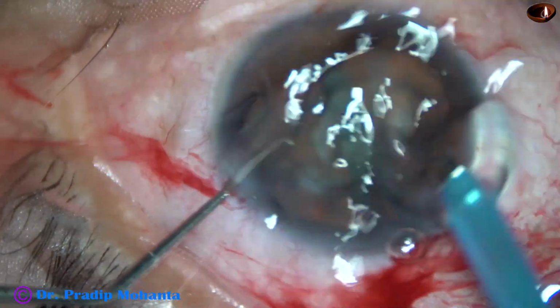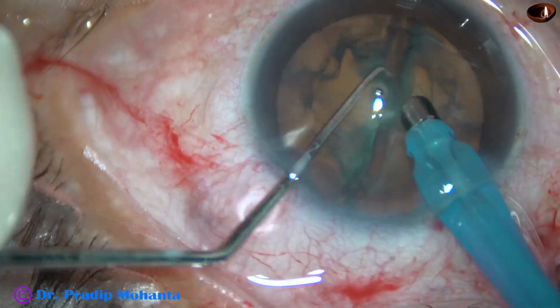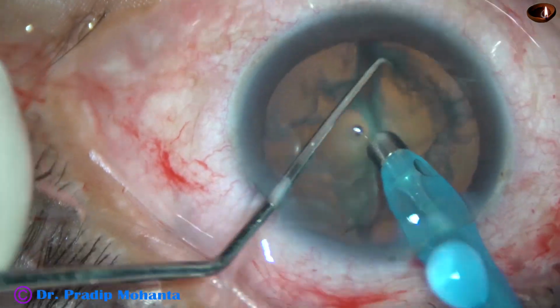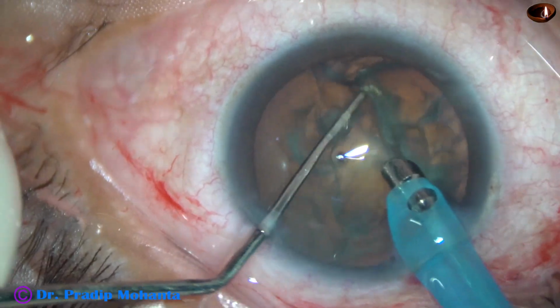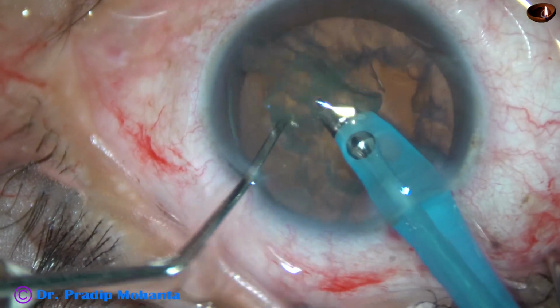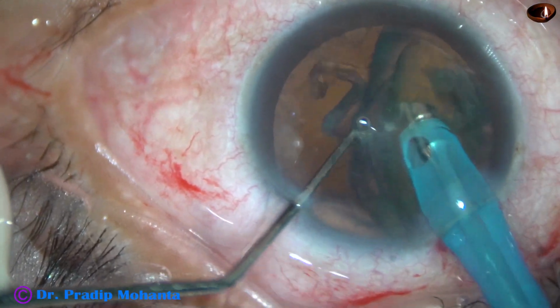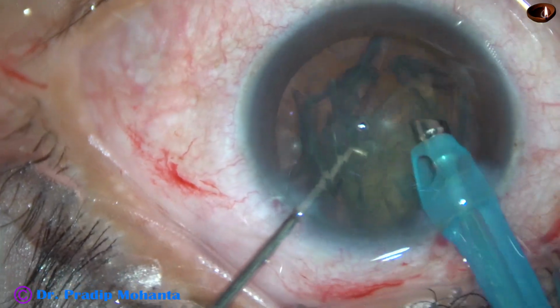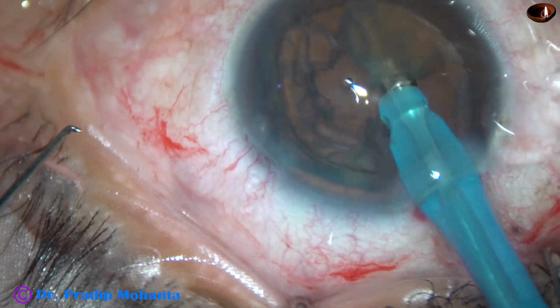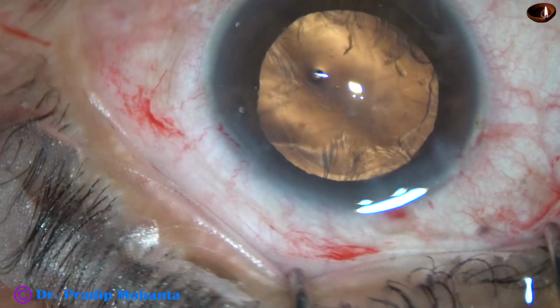And now the tip of the phaco needle goes into the anterior chamber, and within a minute the two halves can be managed. Just hold one half and emulsify, since this is a soft cataract, and this half is tilted and it is eaten off. So a lot of time has been saved by this instrument.